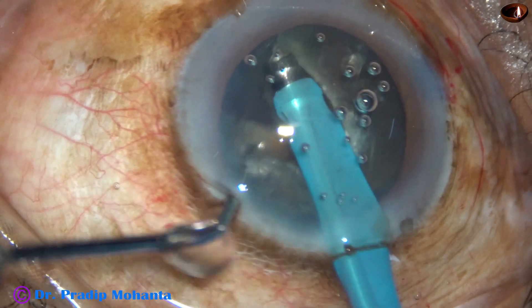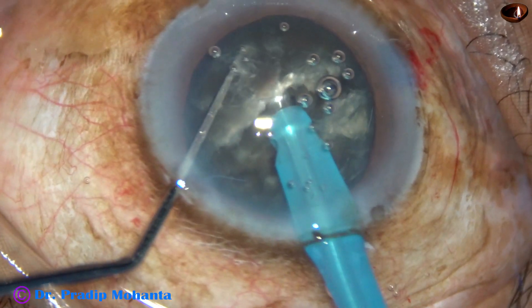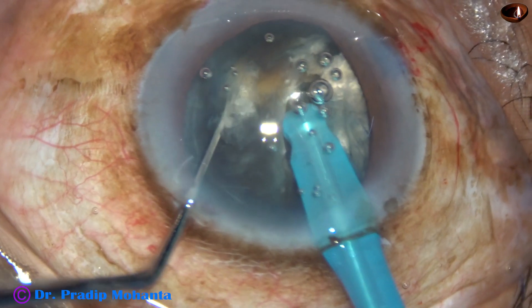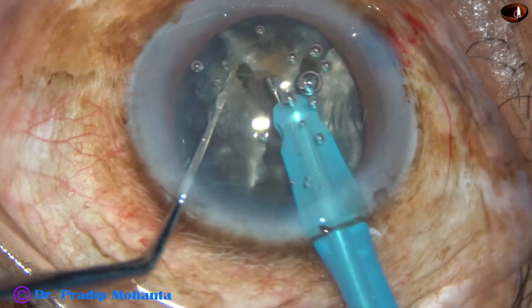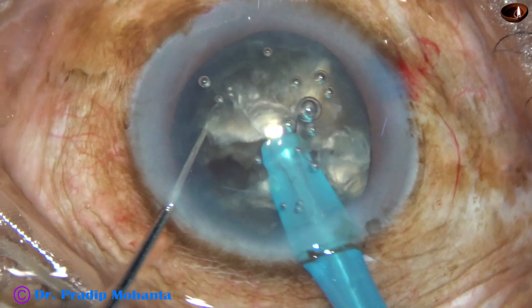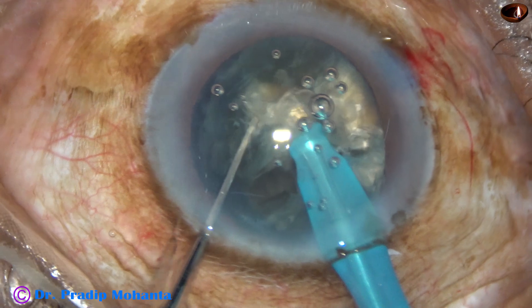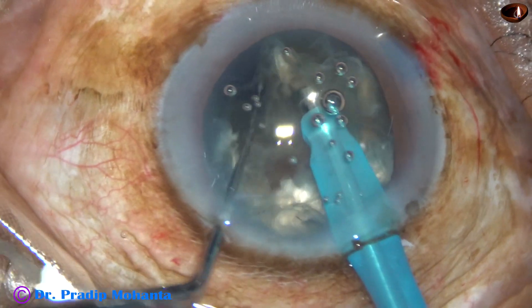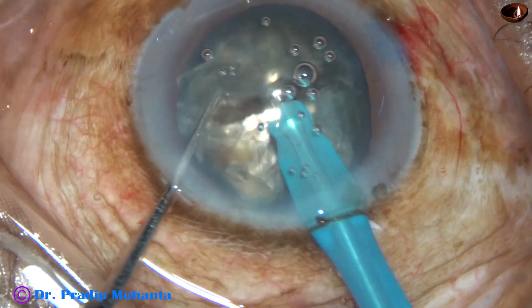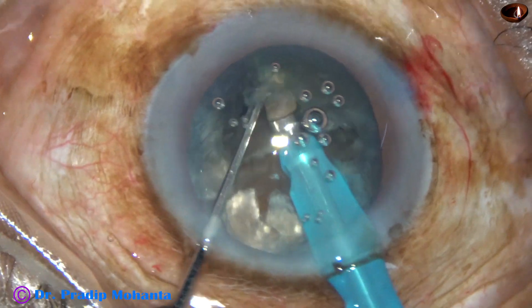The two heminuclei are not of equal size. This is the larger heminucleus — I am going to divide it into three pieces. This is one piece; it is totally free. Now I come to this mass and divide it into two more pieces. Thus the heminucleus has been divided into three pieces. I rotate and come to the other heminucleus — this heminucleus is small. I just chop it once, so it has been divided into two pieces.